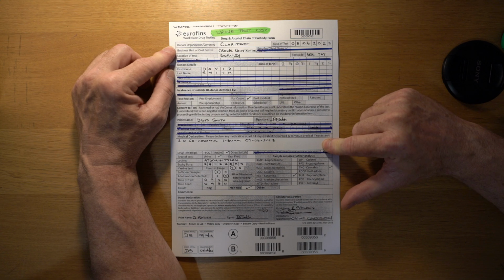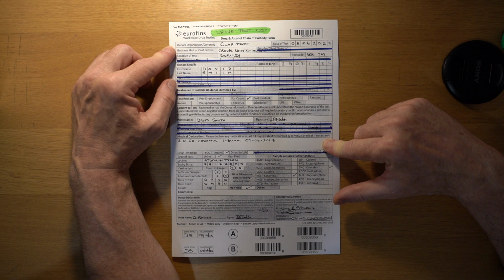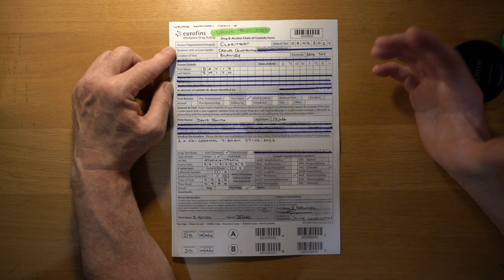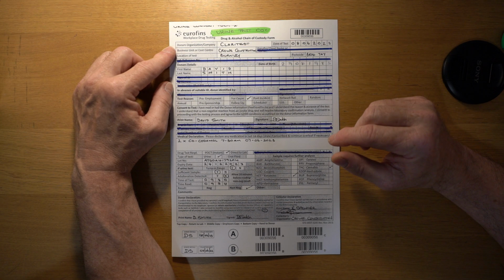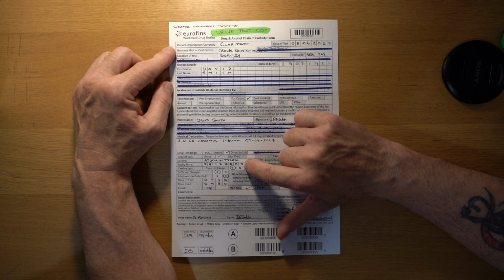Medical declaration next. So this person had taken 2 co-codamol 7:30 on the 7th of 6th, so I wrote details of medication taken the last 14 days there. Underneath that, POCT, so that's a point of care test. So when you did your initial first line test, you would have had details on the packaging there. So it was a urine test. The lot number of that kit that I used written there, expiry date there.